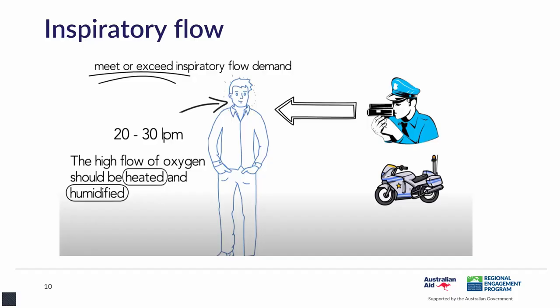I think that probably one of the more complicated things about this theory is that as clinicians, without fancy machines, we actually can't measure inspiratory flow demand.